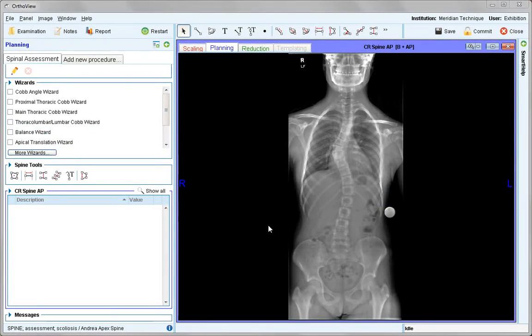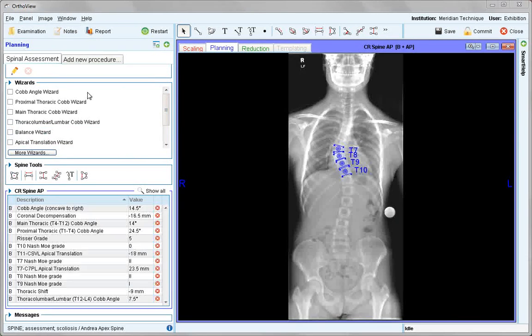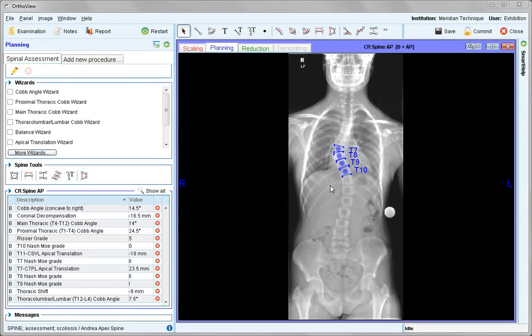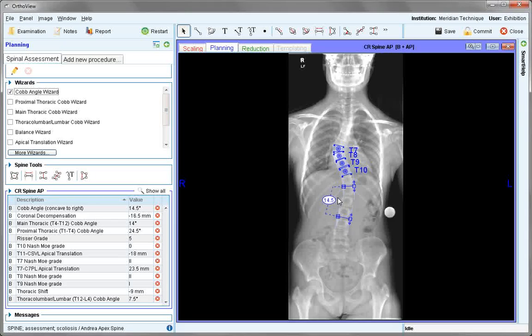Each of the wizards has been pre-positioned just to aid with the speed of this video demonstration. This is the wizard set for the AP spine. You'll note that some vertebral bodies have been previously identified on the image to aid in the demonstration process. To begin with, we have the Cobb angle wizard which automatically records whatever value is identified.